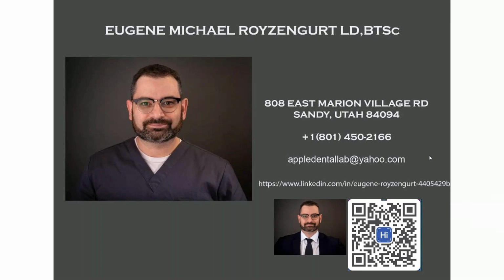Basically, when you're cementing a bar to a temporary titanium cylinder, it's not as strong as having a monolithic structure, so that would make it slightly weaker in some areas. Is it a lot stronger than not having any kind of reinforcement at all? Yes, absolutely. My personal recommendation is I would probably use that for a long-term temporary. As a permanent structure, you might be able to get away with it, but you would obviously want to charge less than you would for titanium, because they're not getting as much value out of it. Just in my opinion, but I could be wrong.